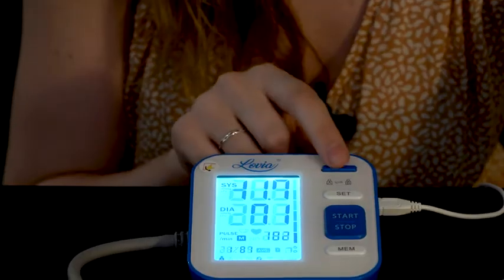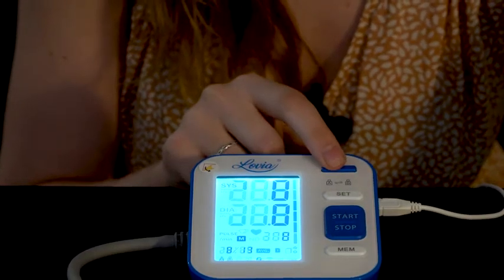This product's really good because here you have a dual person setting. If you press the button it will switch from person A to person B, and for each person the device will save up to 120 memories — so in total it's 240 memories, which you can access here.